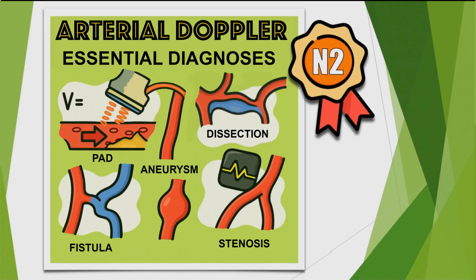You'll see, I put together a montage of different parts of the training that deal specifically with the aorta. I hope you'll find it interesting and informative. And then, it's also a way for me to share with you a little of the quality of the training I put in place to help you as much as possible to develop this exciting tool.